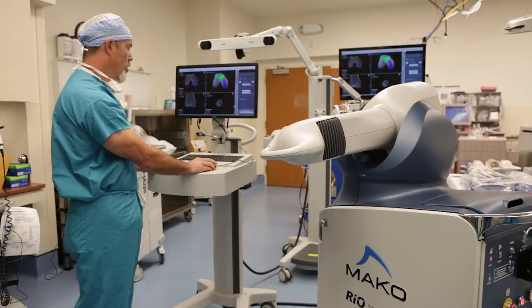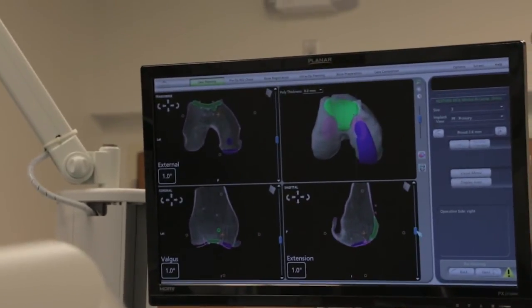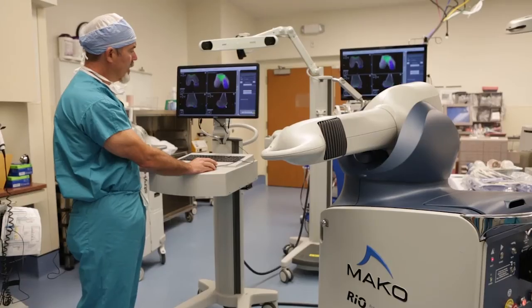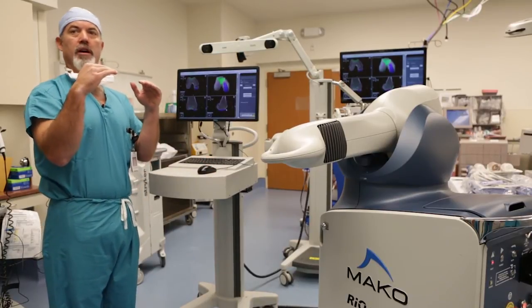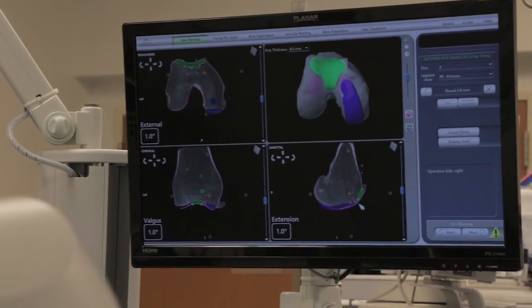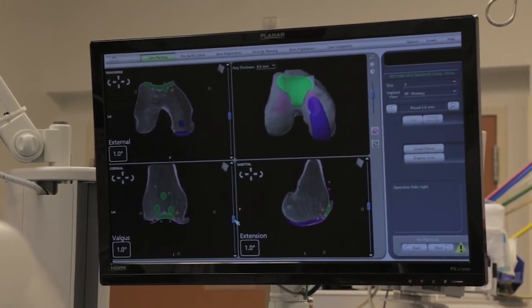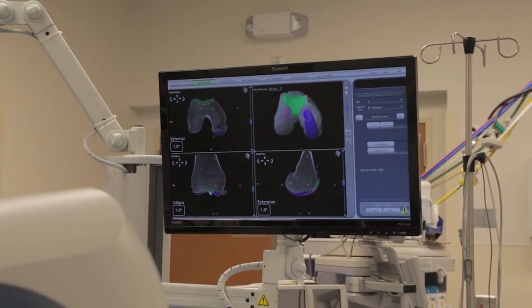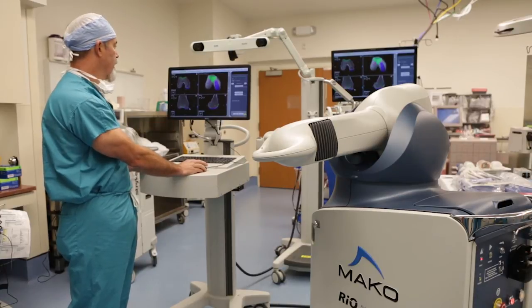I can scroll through all the cuts to see the relationship of the implants — the tip of the femoral component to the tip of the patellofemoral component. The important part is the visual axis line, this pink line, which shows those joint surfaces are congruent. You don't want any speed bumps or step-offs, and this surgical planning tool allows us to ensure that. In the coronal view, the visual axes confirm there is no step-off between the tongue of the patellofemoral component and the runner of the femoral component — they line up completely flush.